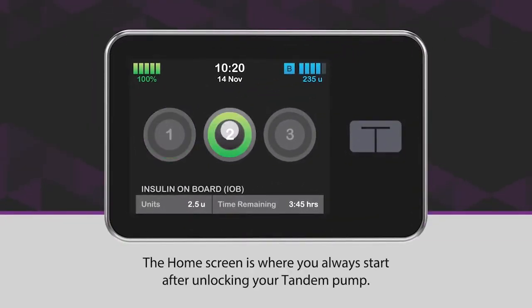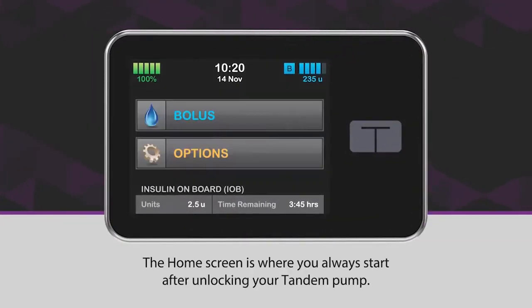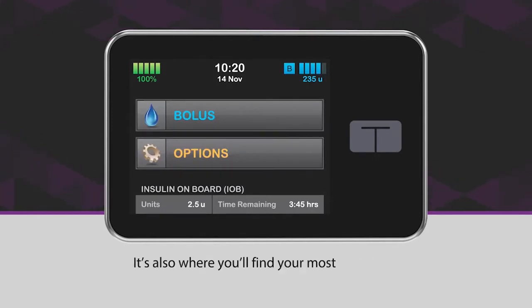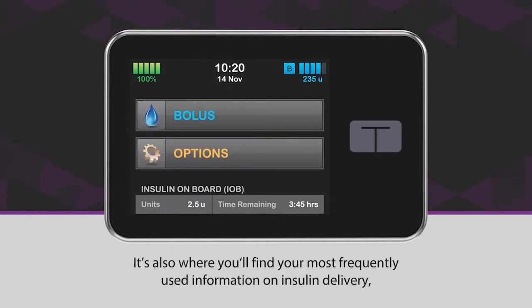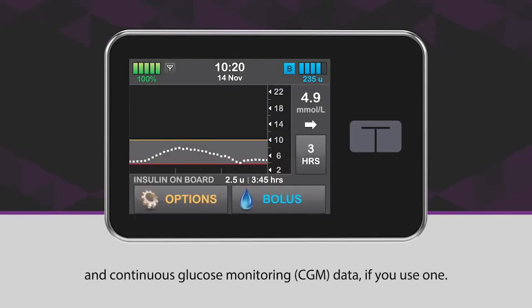The home screen is where you always start after unlocking your tandem pump. It's also where you'll find your most frequently used information on insulin delivery and continuous glucose monitoring data, if you use one.